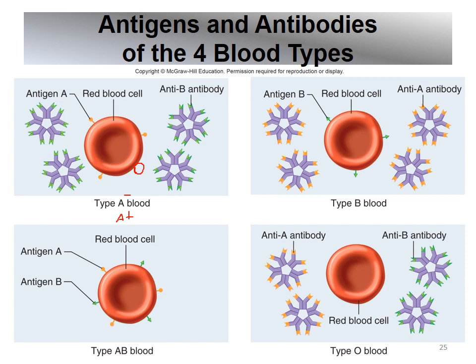But at birth, the only antibodies that would be present are anti-A or anti-B antibodies. Those are there to attack their respective antigens. So anti-B attacks B, anti-A attacks A. And it's called agglutination, and it happens instantly on that. On the Rh factor, no one is born with any anti-Rh antibodies. So it would take a cross-contamination twice to have any real effect. And if it happens twice, then you get agglutination, and that can be a big problem.